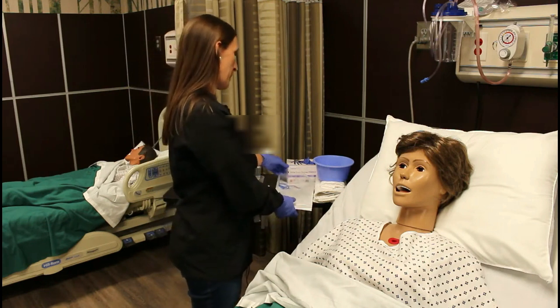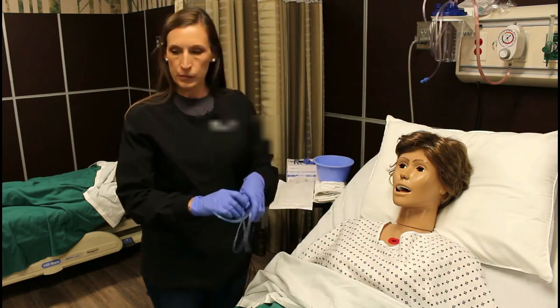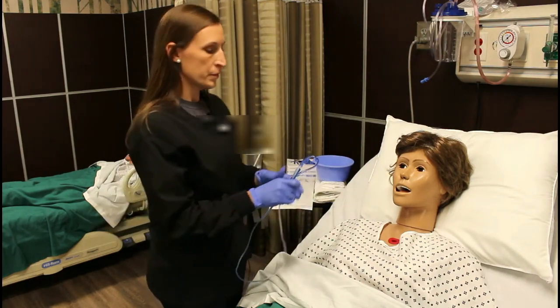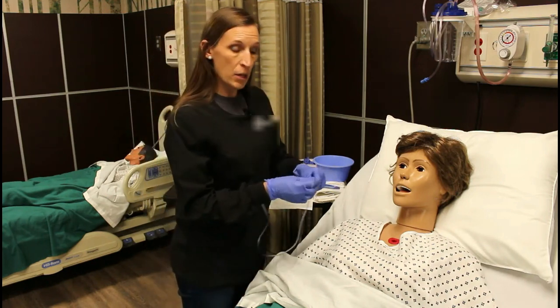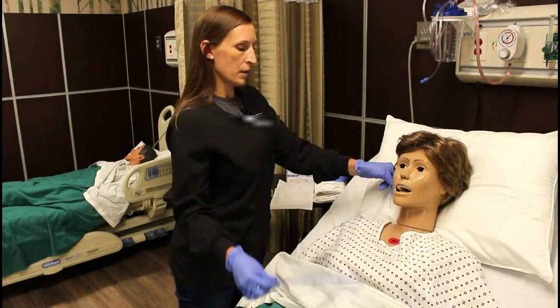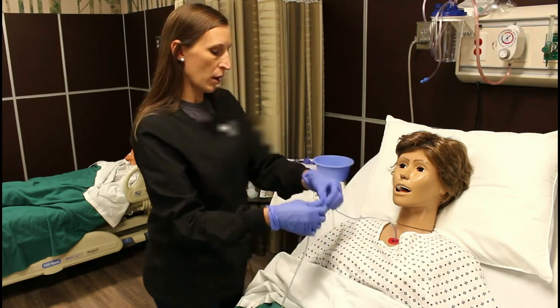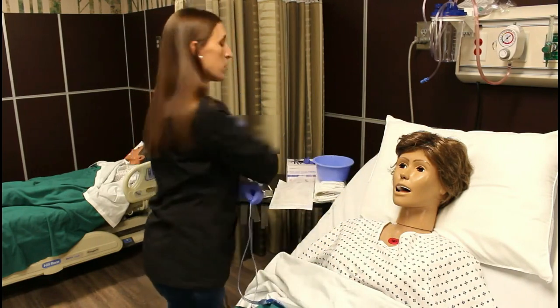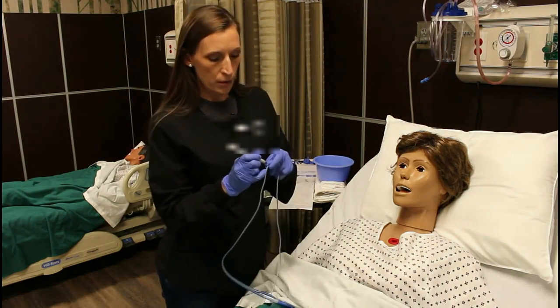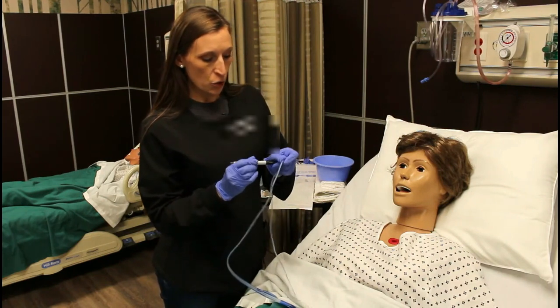Now you're going to measure your tube. You're going to do the measurement from the nose to the earlobe, then hold it there all the way to the xiphoid process. You're going to mark that spot either with a piece of tape or with a Sharpie — a Sharpie is a little bit easier. Make a mark so you know how far down to put the tube.